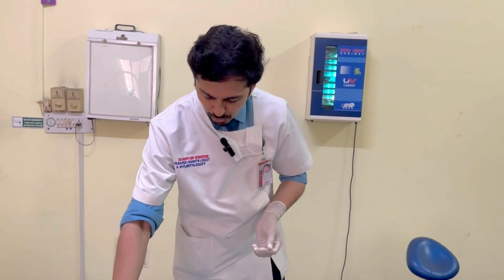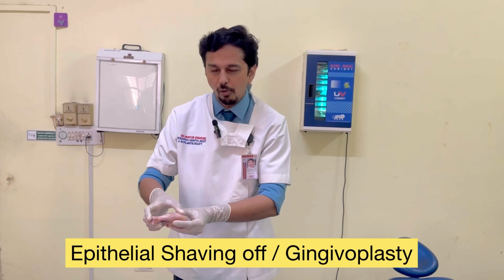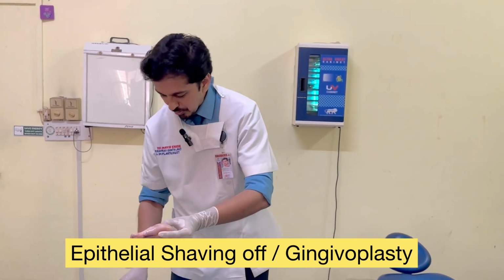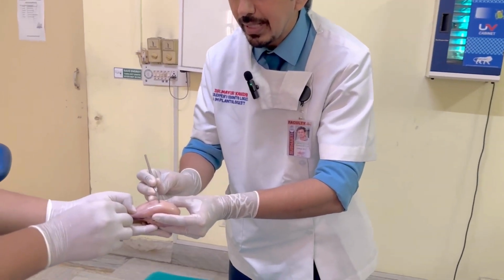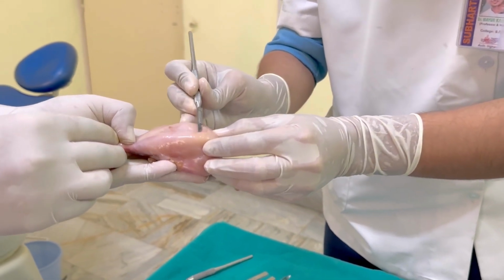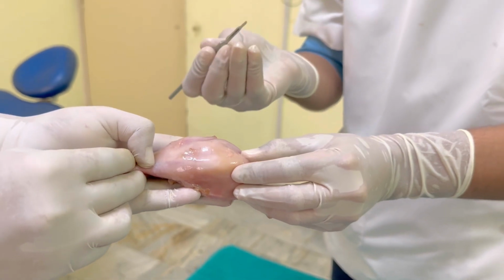However, there is an issue. Whenever I need to do any procedure in which I need to simply shave off the tissues, that is the superficial part, shaving off doesn't come out that easily with a blade. I can shave it off but it won't come out that smoothly. So this is where a thermal modality is more useful.